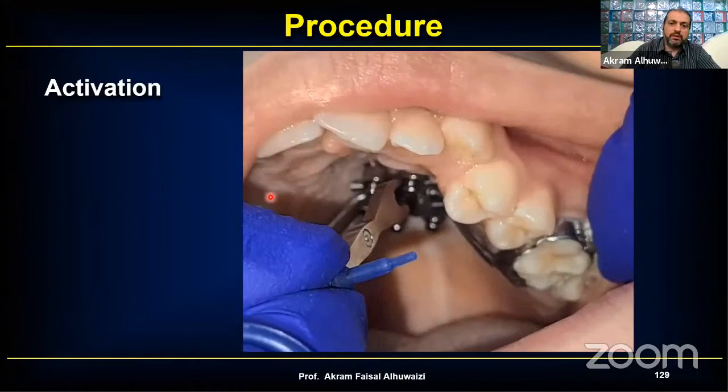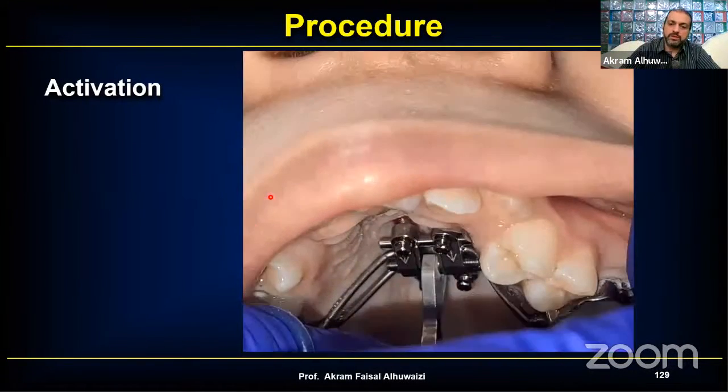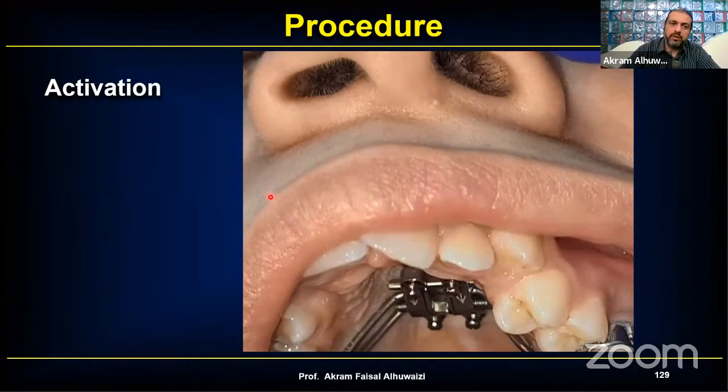And I advise the patient to use this ratchet, and I instruct them to do that. I also give them a video of this and send it to their WhatsApp number, so that the patient can just have this as a reference. Because so many patients, they would push it in and then reverse back before they pull it out.